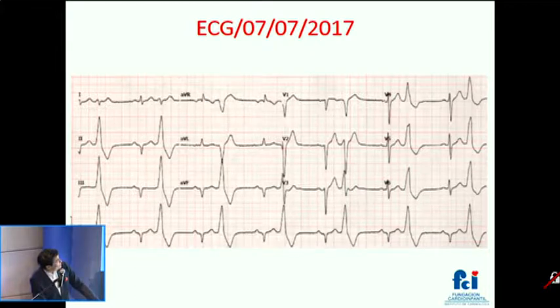In this case, you can see the sinus rhythm. I see a Q wave in lower leads that don't meet the criteria of a necrotic wave. And it's very important in terms of interpreting the origin of the extrasystole. We must understand where the forces are transitioning in the sinus rhythm.